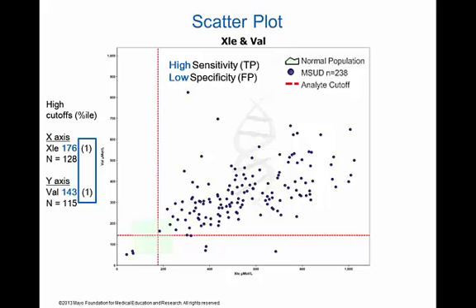If, for example, we plot the respective first percentiles of the cutoff ranges, 176 for isoleucine-leucine and 143 for valine, the detection of true positive cases becomes almost perfect, but the overlap with the reference population, the green area, will cause an unacceptably high number of false positive cases.